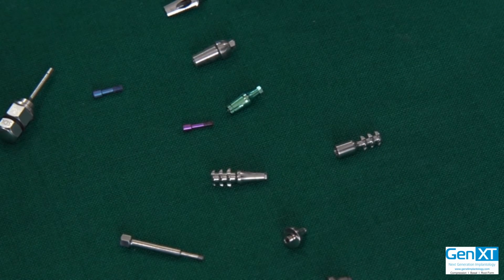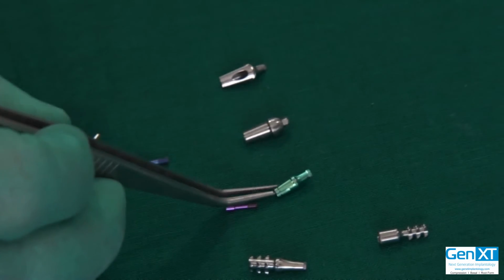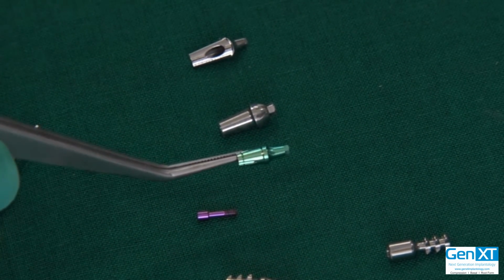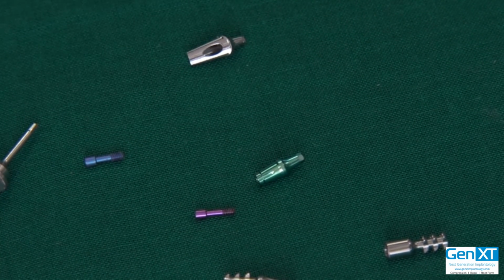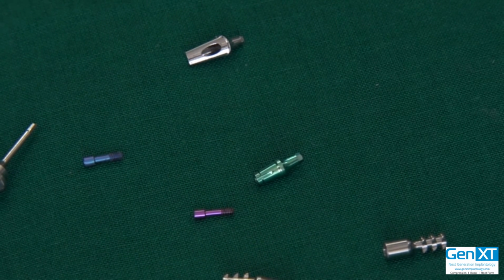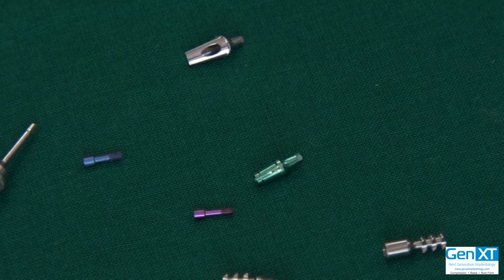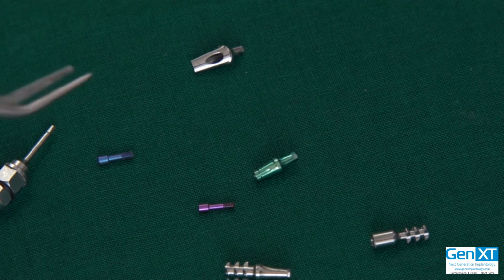That is impressions. Now regarding abutments, here you can see 3 abutments. There is the basic abutment, or the implant mount, that comes along with the implant. It's similar to the abutment of the one-piece implant. Then there is the one that you can purchase. These are more anatomical in shape, and they are available in all angulations, 15 degree, 25 degree, and different gingival thicknesses, 3, 5, etc. It is also possible to have a locator abutment to use for overdenture.